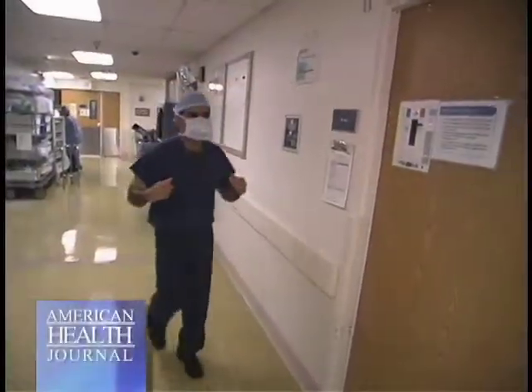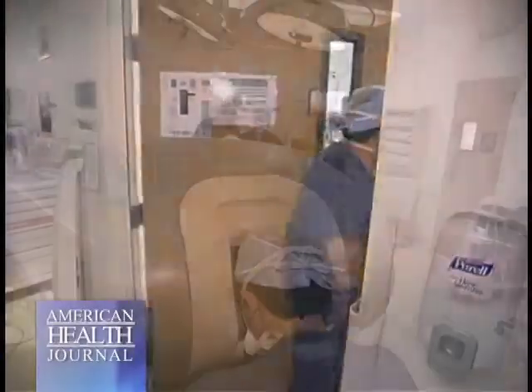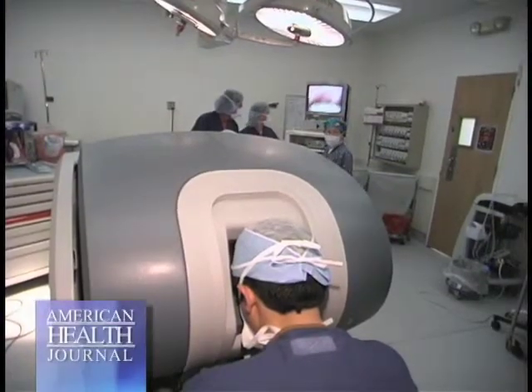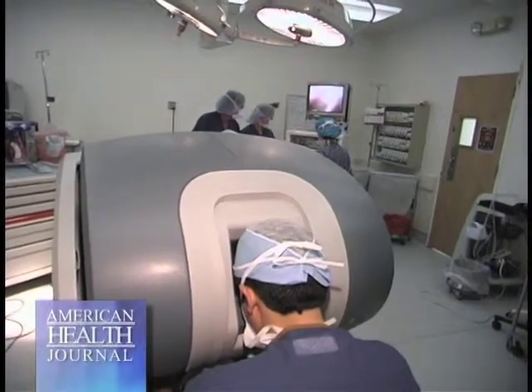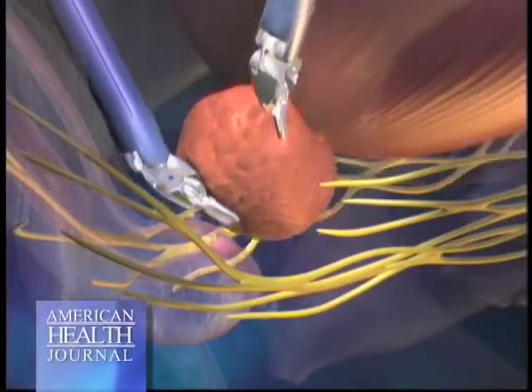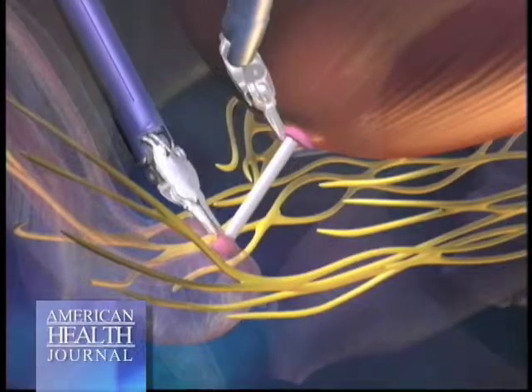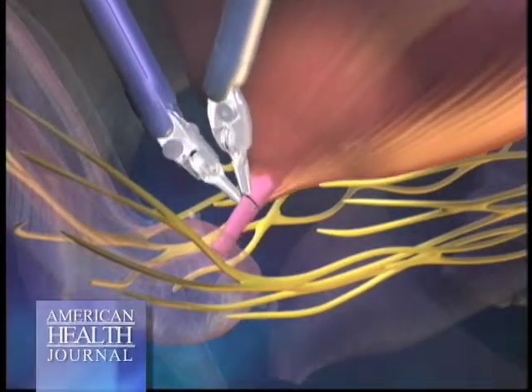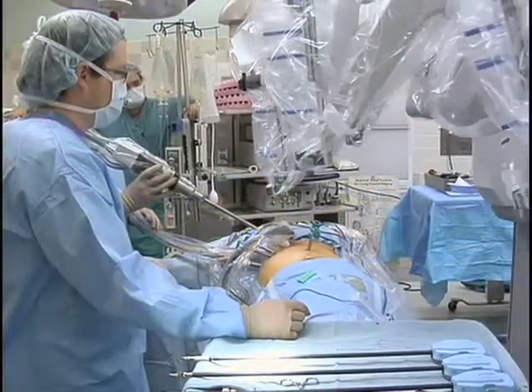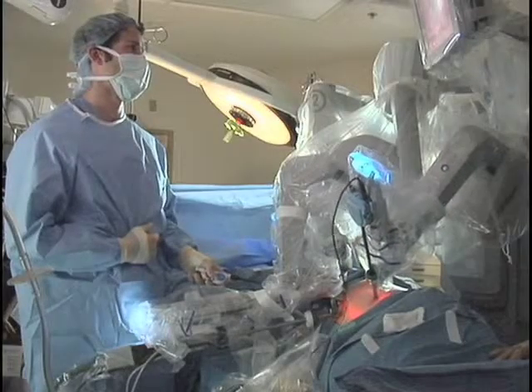And he told us how robotic surgery is used to treat prostate cancer. One of the treatments for prostate cancer is robotic surgery. And what that entails is removing the prostate gland, and then the bladder and the urethra are sewn back together, again reconstructing the urinary tract. And this can be done through small incisions, and we use special instruments that are attached to a surgical robot.